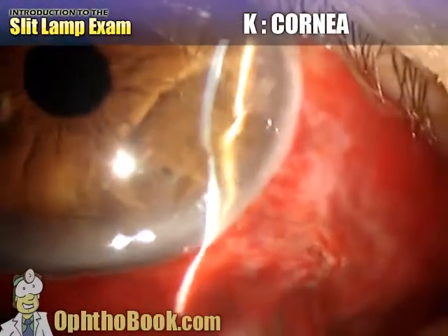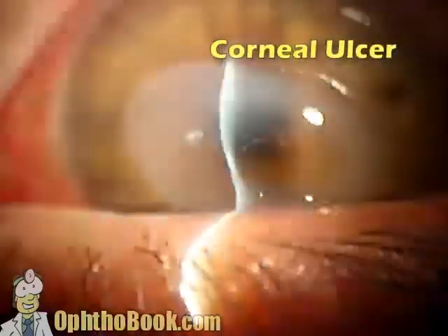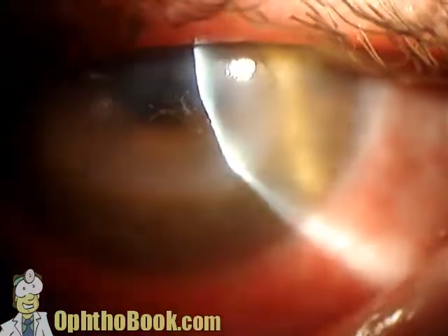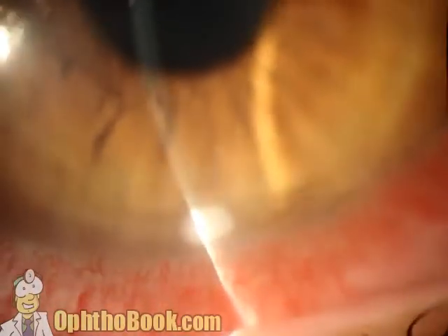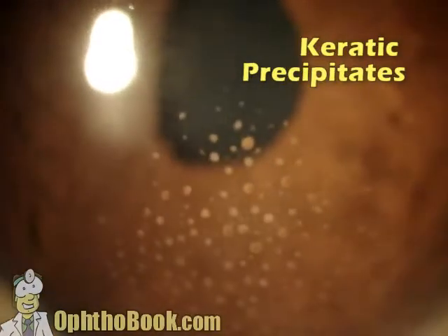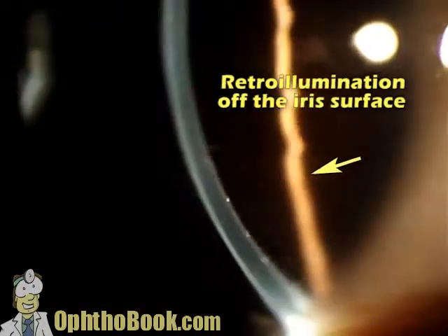Moving on to the cornea: this is a dellen — an area of localized dryness causing thinning of the cornea in one little spot; hydrate it and it thickens back out. This is a corneal ulcer thinning right in the middle — you can see how thin it gets as the slit beam moves across it; it ended up perforating a few days later. This is an experimental intracorneal lens from about 15 years ago — the dark gap is visible right in the middle of the cornea on cross-section. This is a corneal infiltrate from contact lens use on the front of the cornea. This is KP on the back of the cornea — confirmed using the slit beam showing it lights up on the back surface, and you can use retroillumination off the iris to see those dark spots.